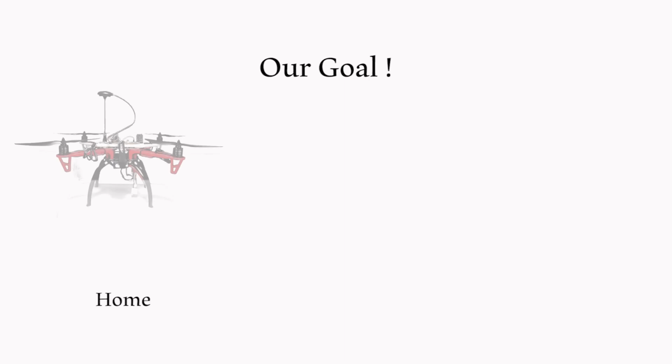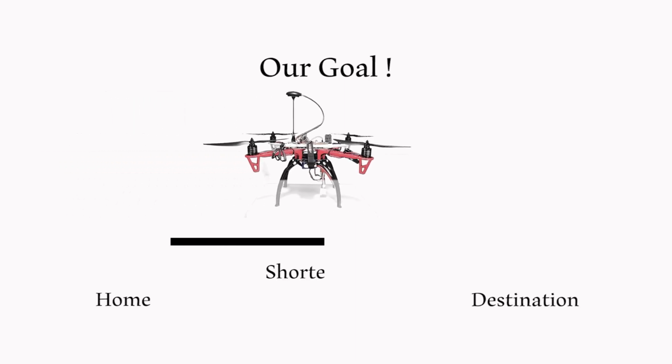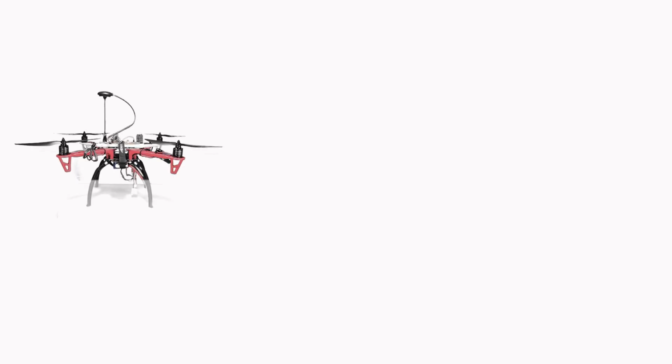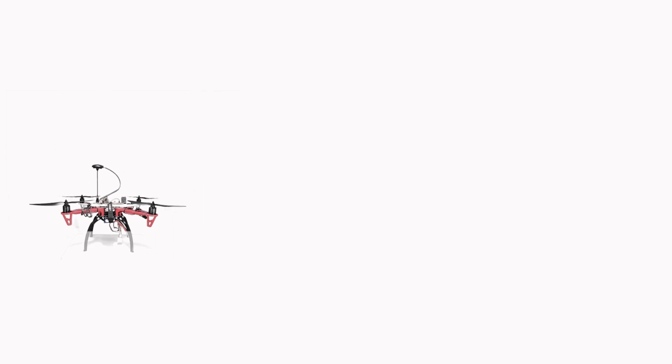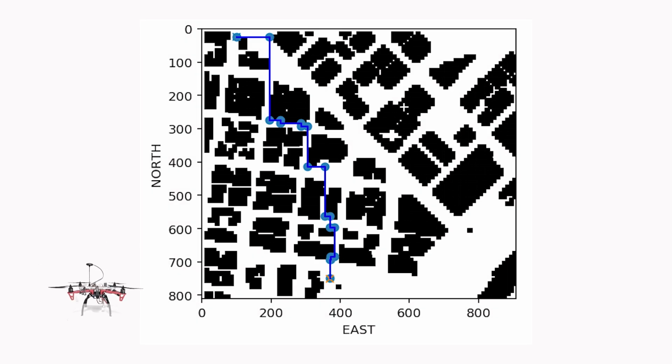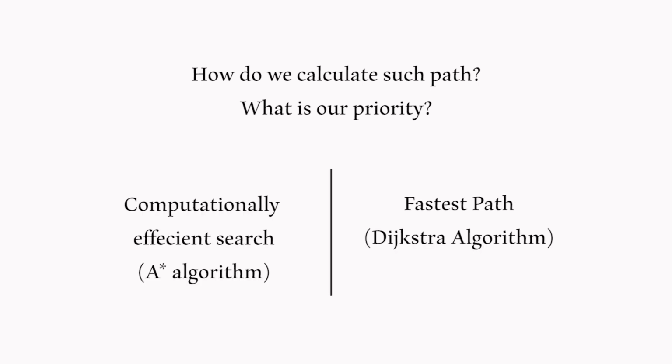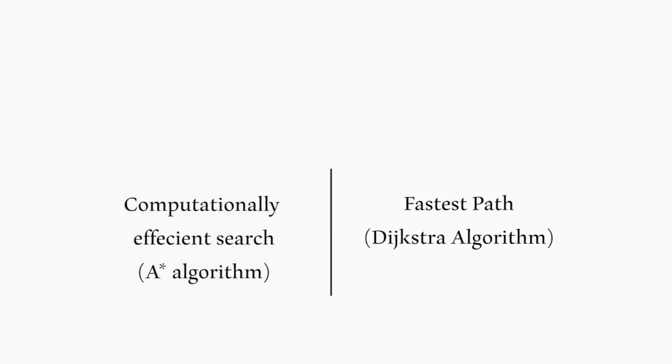Path planning is a computational problem to find a sequence of valid trajectory points in the space. So we had to make sure that the drone is capable of flying autonomously and arrive on time. So we had to plan the path. Our main goal is to introduce a fast, reliable drone that can take the AED to the patient as fast as possible. Search algorithms are used to find the path from start to the goal. We use satellite imagery to get an image from a satellite at the required location. There are many search algorithms that find this path, as a fast computationally efficient search will not affect the overall time as the fastest path.